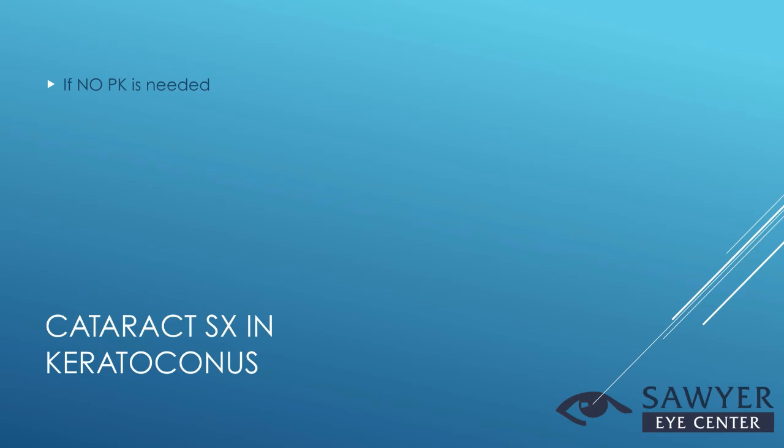Another thing I always do in keratoconus cataract surgeries is put a suture in the incision. My cornea attending, Dr. Mauger, always told me, do not trust a keratoconic cornea. These wounds, more than any, are likely to leak, or if a person just barely rubs them, they can bust them open much, much easier. They're very floppy, unstable corneas. And I find putting a suture in and taking it out at a week or a month is just an easy thing to do. I might as well save myself the headache in the long run by doing the work up front.